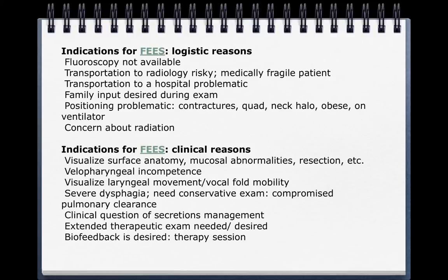Okay, now let's look at the reasons why we might want to have a FEES evaluation of possible dysphagia. And these fall into two categories. There are no really good logistic reasons for having an MBS. It's expensive. It requires that the patient be transportable and is not obese. It requires that it's okay for them to be radiated. There's no good logistic reason why you might want to have an MBS. The payoff, of course, is the film. But there are other reasons why you might then want FEES.